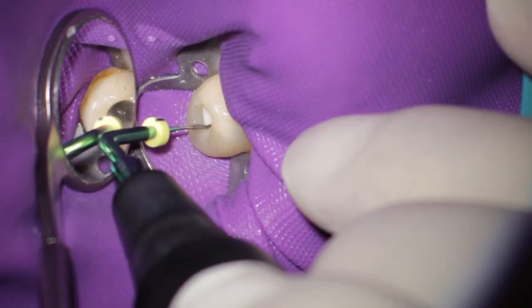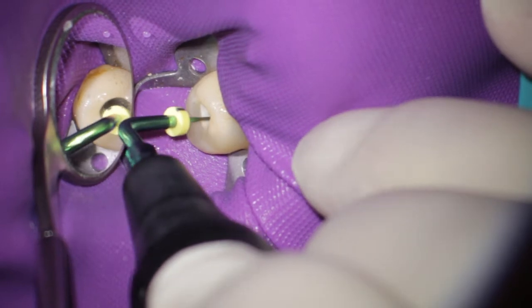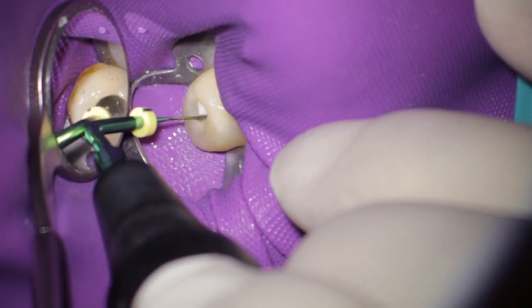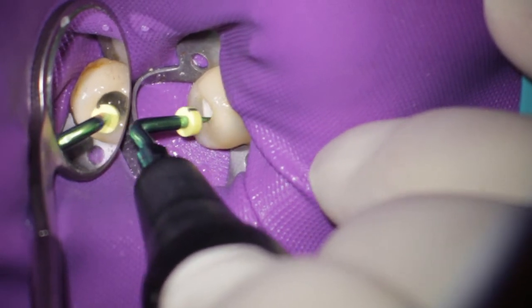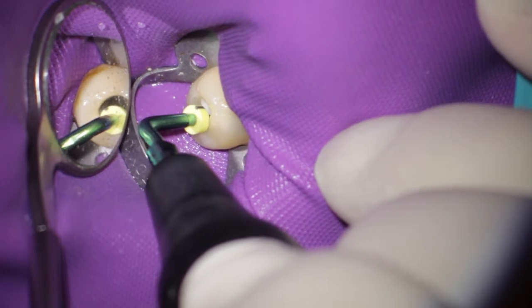You heard this a few minutes ago in my lecture about the theory of acoustic streaming, and now you can see it in real life. You have to try it at your next treatment. Gently pull the tip out of the fluid and watch what happens.